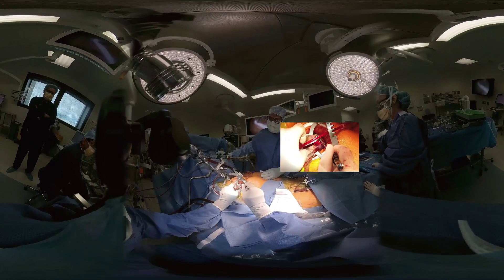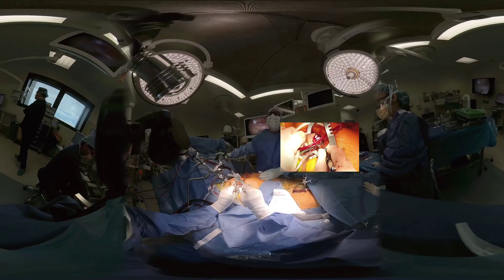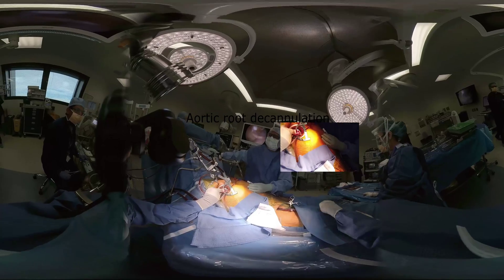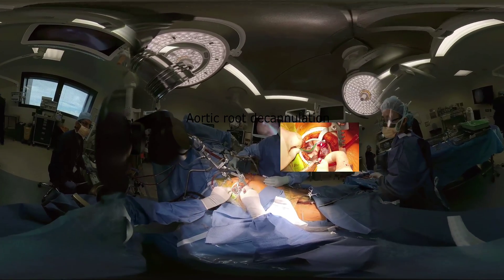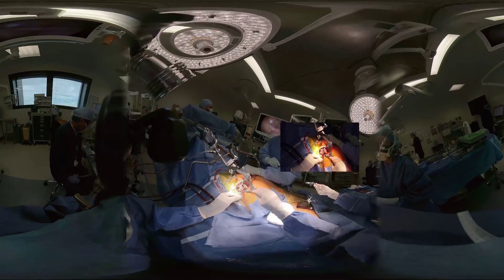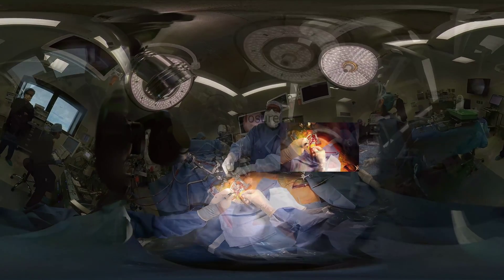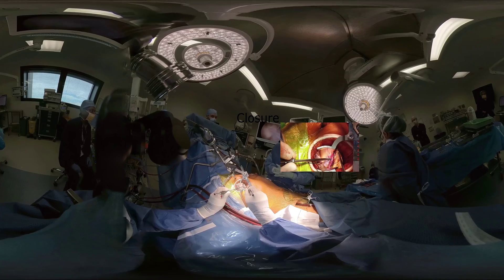Following reperfusion of the heart, an echocardiographic assessment of the valve for competence and satisfactory de-airing is performed, then the root cannula is carefully removed. Having two purse strings prevents the need for suturing the aorta.